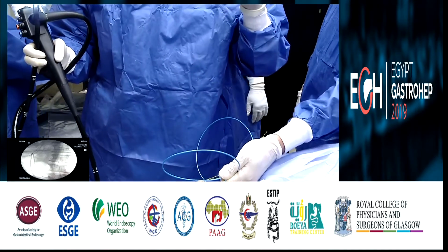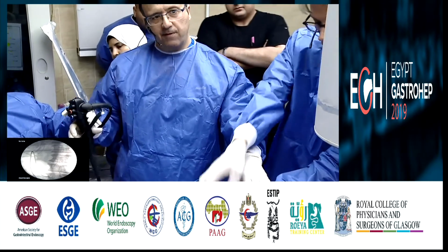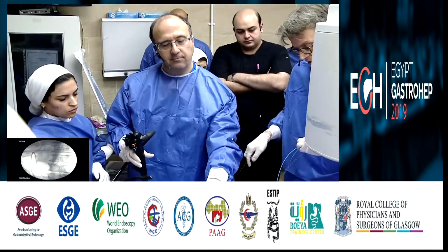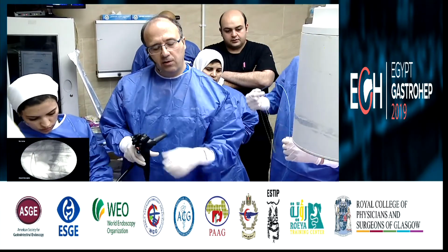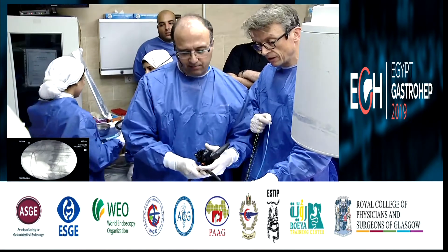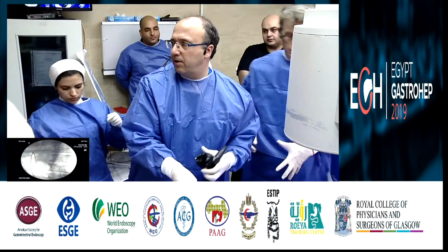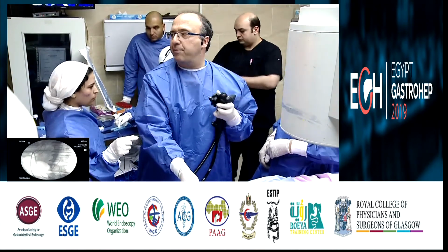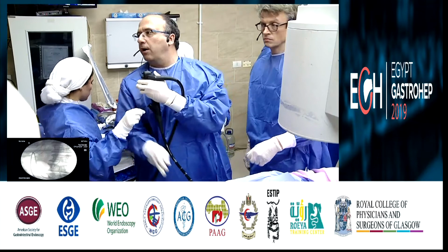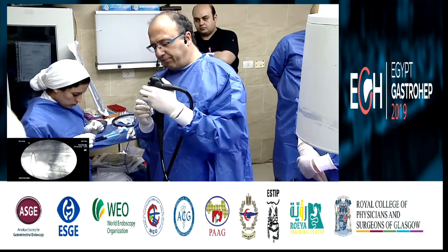So the reason is, we're in trouble. It has already moved. Yeah, it has moved away. Okay, maybe we still have the wire in place. Maybe we can try to advance it. No? It will not go through. So the catheter is to be able to image the... no, we need to do it again. So you'll remove, see everything? Yeah, pull it out. Remove the wire, give me the Oasis. The Oasis, flush it and put the wire through the Oasis. We have miscoordinated during endoscope removal, and the nasobiliary catheter has come out from the distal duodenum. So we have to go back again.